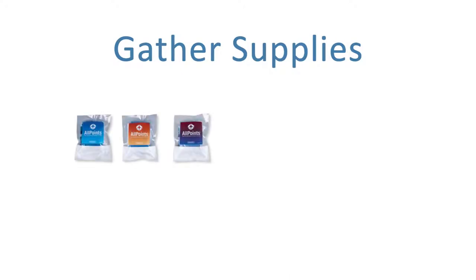When beginning a central line dressing change, gather your supplies as needed. The All Points Dressing System and Braun Injection Caps — the number of caps is determined by the number of lumens the line has.